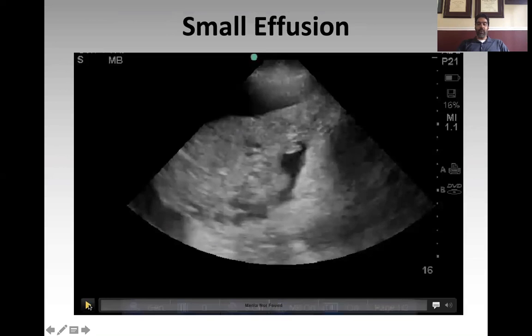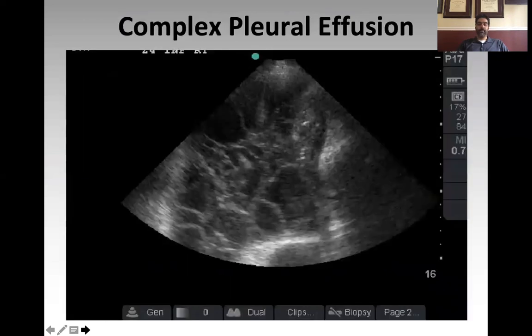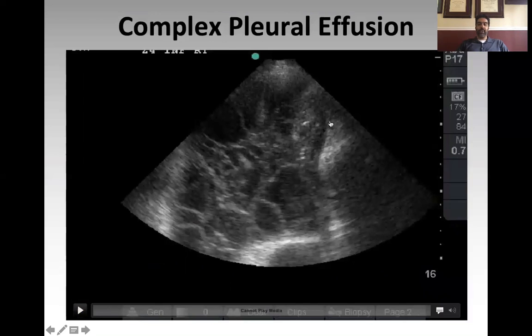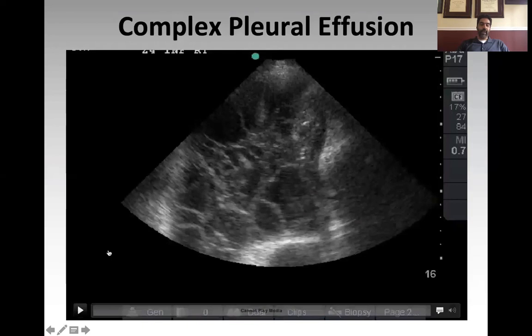Here's an example of a small pleural effusion — there is consolidated lung with a simple, small pleural effusion around it. As opposed to this, which is a large pleural effusion with consolidated lung: the lung is tiny, de-aerated with a soft tissue appearance and sonographic air bronchograms, surrounded by a large simple effusion — this would be safe to drain. And here is a complex pleural effusion with septations, fibrin strands, and complexity visible in the fluid collection, which may require a chest tube and more complicated management.